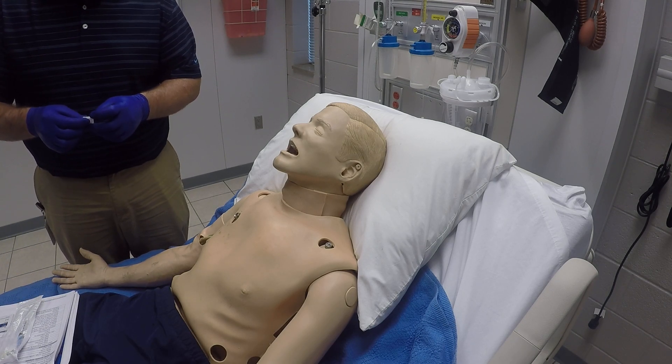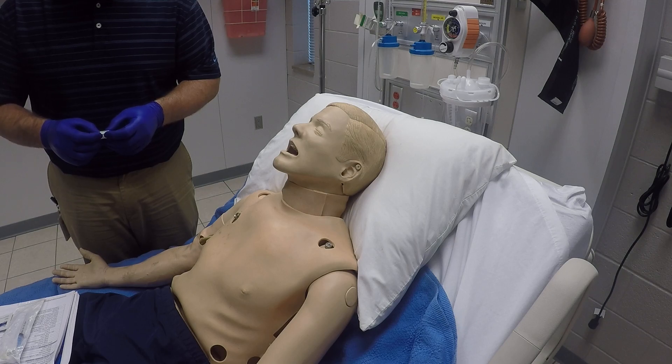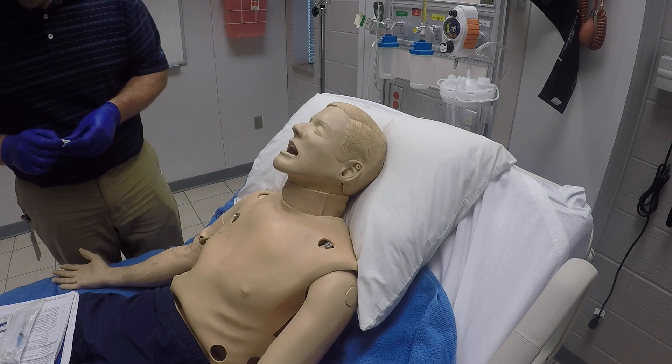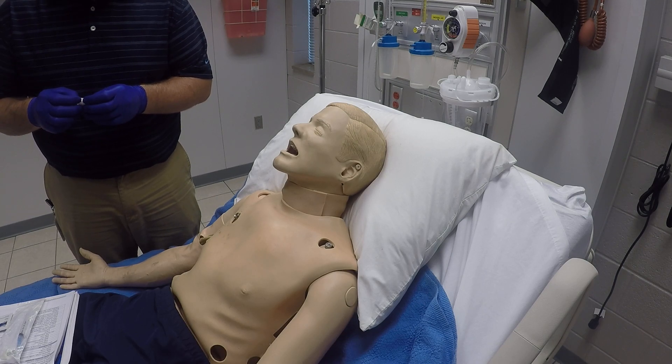First we'll take our medication and check our five rights: make sure it's the right patient, the right medication, the right dosage and concentration, the right time to give it, and the right route — which is intranasally today. We're also going to check the medication and make sure that it is clear, with no particulates floating around, and that it is not expired.